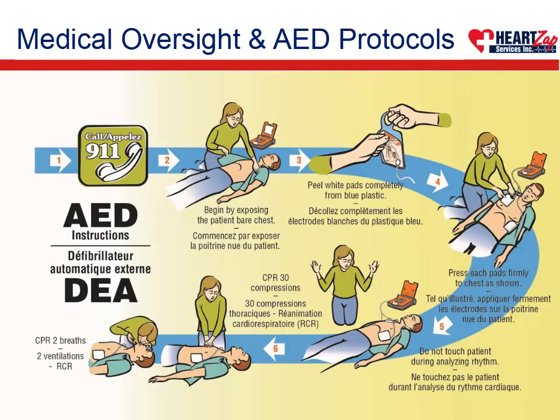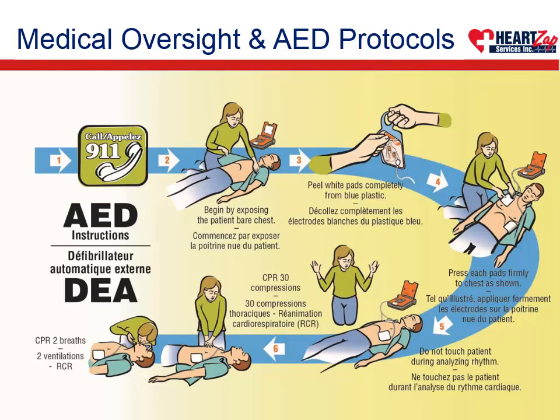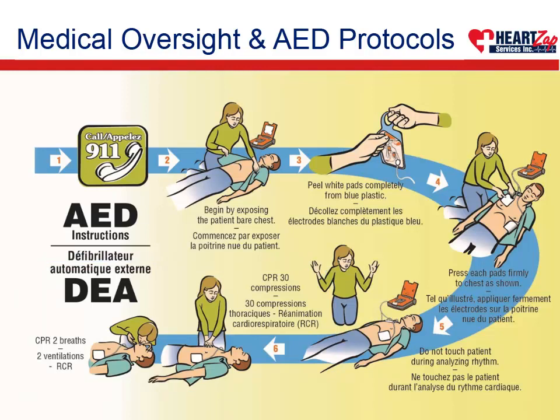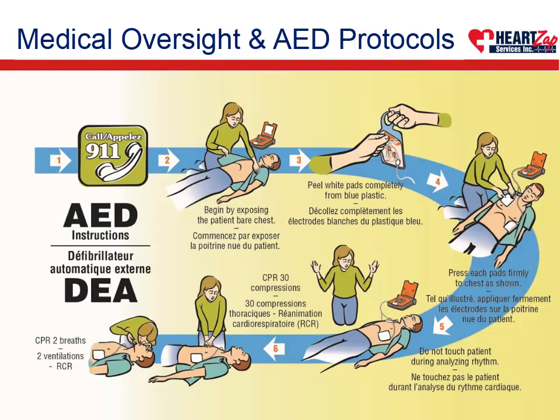The AED determines if a casualty needs a shock before starting each 2-minute interval of CPR between analysis. If no shock is needed, CPR will be recommended. If a shock is needed, the AED advises the user to establish scene safety and push the shock button before resuming CPR.